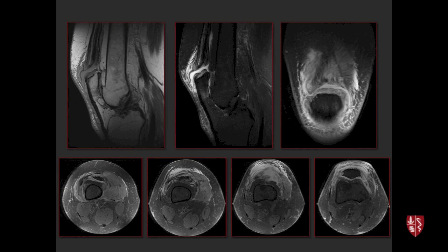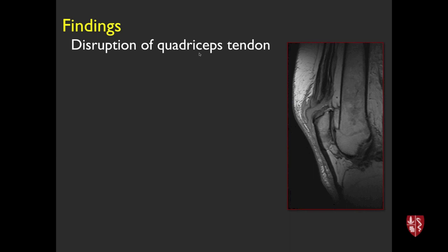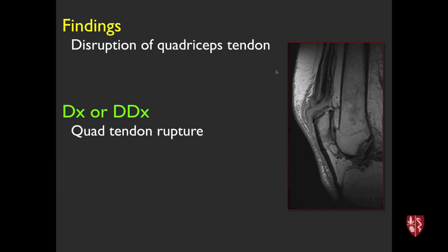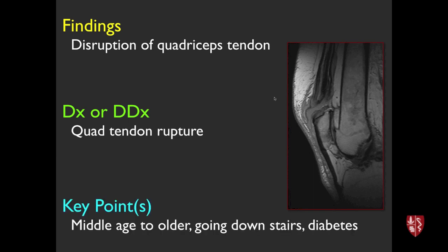Older man in his 60s with knee pain. Sagittal MRI shows disruption of the quadriceps tendon — fluid-filled gap, with the patella visible below. This is high-grade tearing, essentially a quad tendon rupture. Fairly common in middle-age to older folks, often occurring going down stairs. Patients with diabetes or pre-existing tendon problems are probably at higher risk.